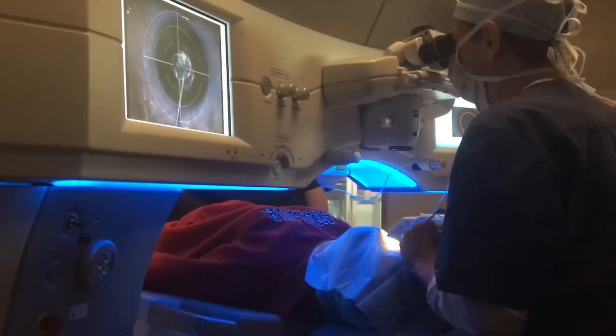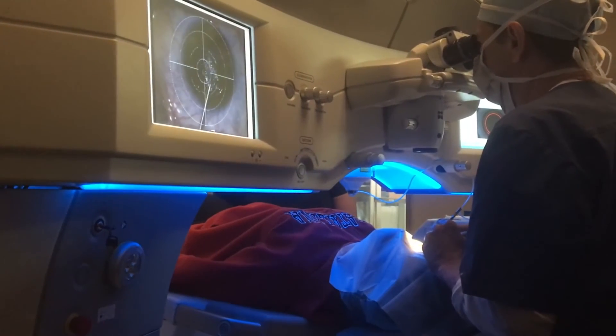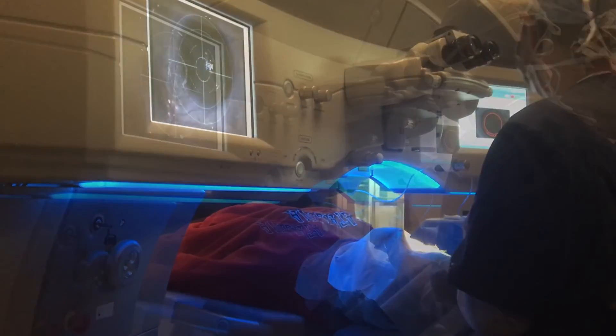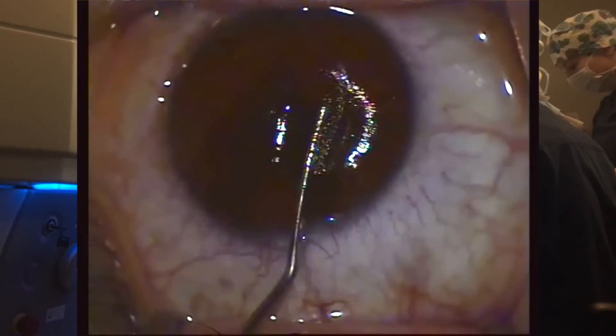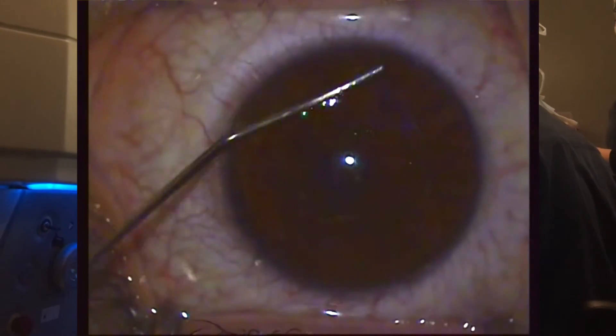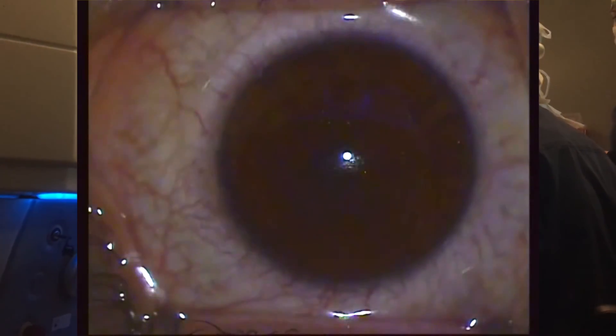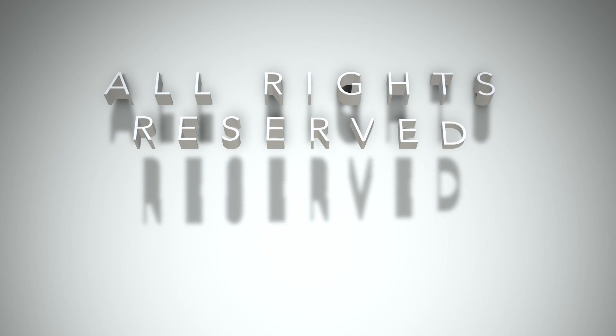Here's an instant replay of that same maneuver where the lenticle is removed and then placed on the cornea to be sure that it is complete. And thus we've finished the procedure. We do irrigate at the end with a small amount of BSS through a cannula and then stroke the cornea once or twice just to be sure there are no microstria, and thus the procedure is completed. Thank you very much for watching.